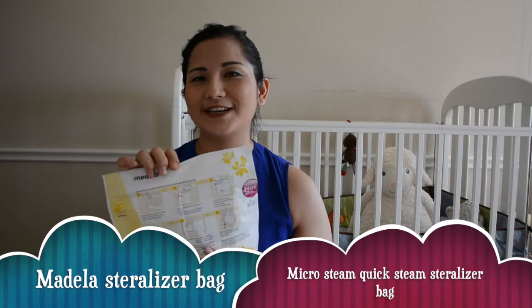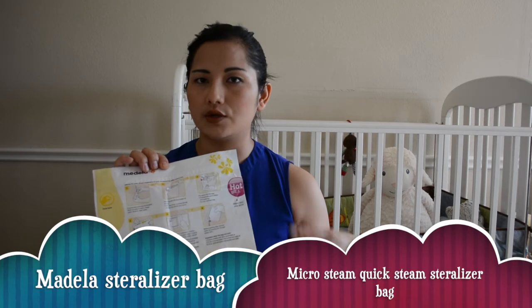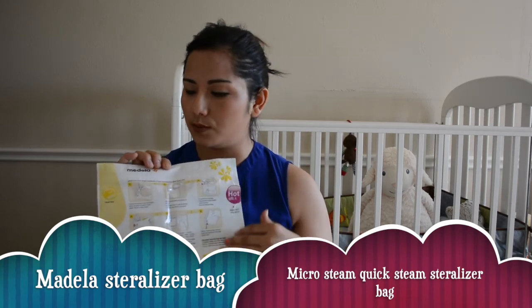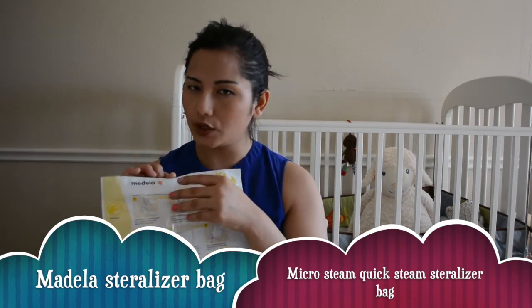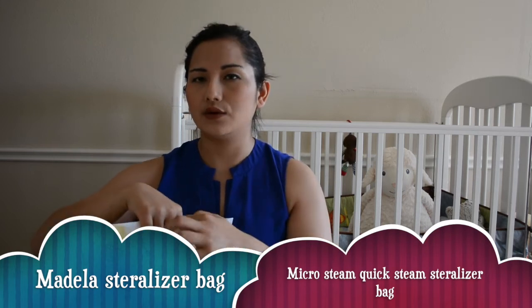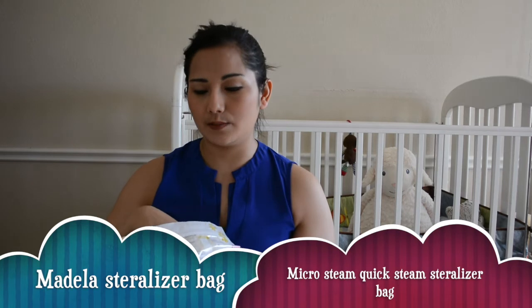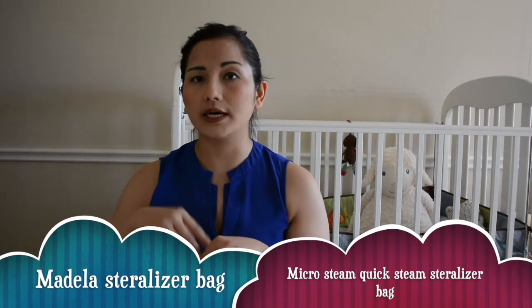When you open one bag, the instructions are very clear — it's very self-explanatory, but I'll still go over it. Once you wash your bottle, you put two ounces of water in the bag. You can measure the water with the baby bottle that you'll be putting in.